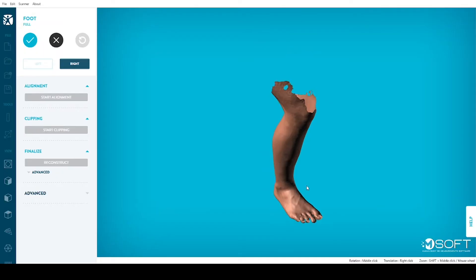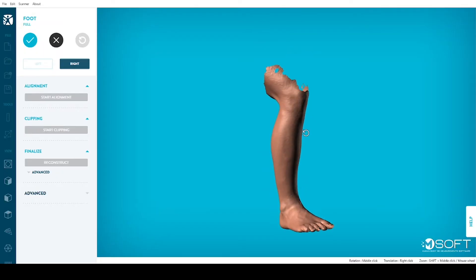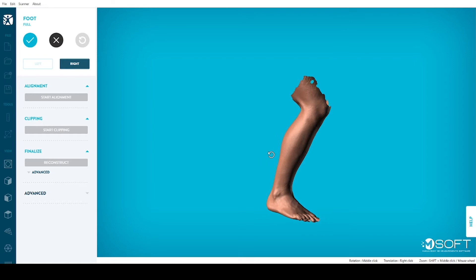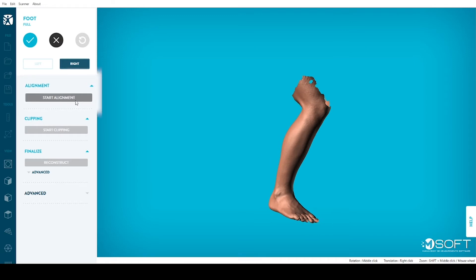Processing an AFO scan with M-Soft is possible in three easy steps. First, click on Start Alignment.